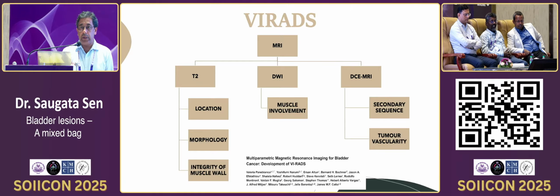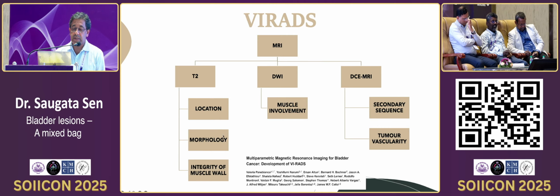Now, when do you use MR? For our institution, we use MR mainly when we cannot use contrast. So creatinine is high, patient is allergic, etc. In these cases, we use MR for assessment of bladder tumors. And then only these 2 sequences are important, T2 and diffusion weighted imaging. And in these sequences, what we try and find out is location, morphology and integrity of the muscle wall, whether the muscle wall is infiltrated or not.